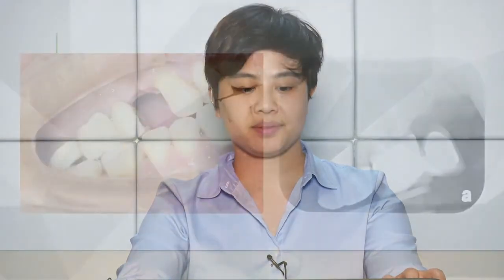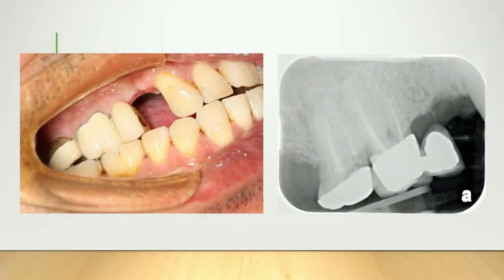Okay, so this patient presented to me a couple of months ago. The general dentist had removed the 1-4. She really struggled with that because it used to be a bridge. The bridge was then sectioned, as you can see, and the dentist referred the 1-6 tooth for me to extract.